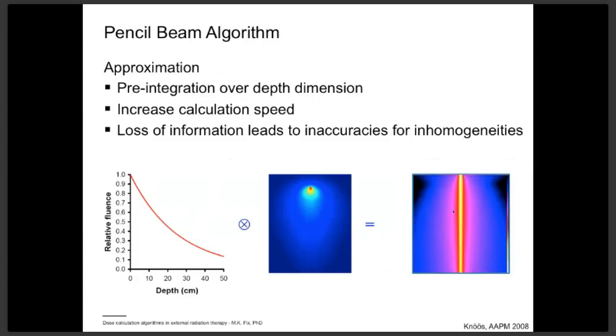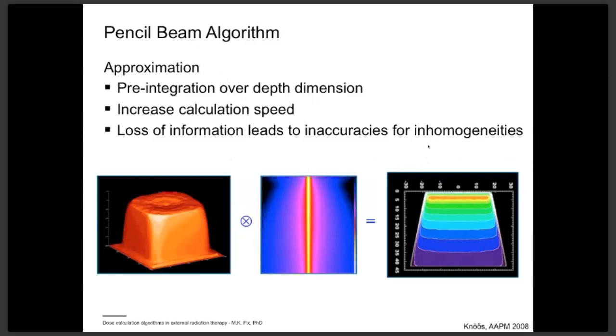Of course, in this representation, the inhomogeneities laterally are not taken into account anymore, and this leads to some limitations in accuracy. For the dose calculation itself, not a 3D distribution of the terma is needed, only the two-dimensional distribution of the energy fluence and the terma.